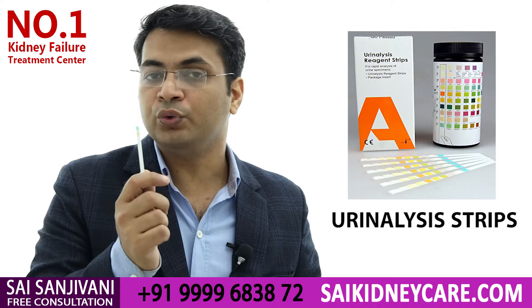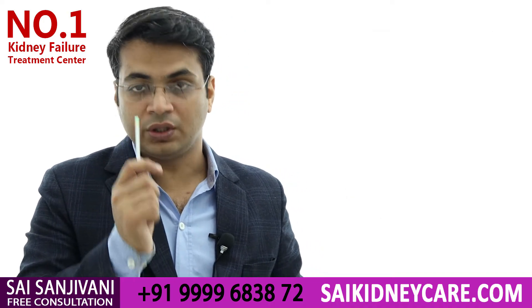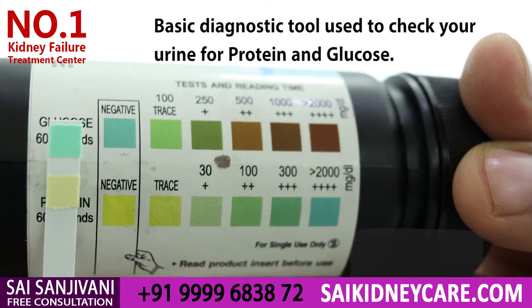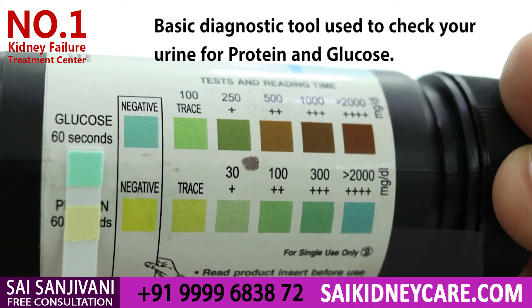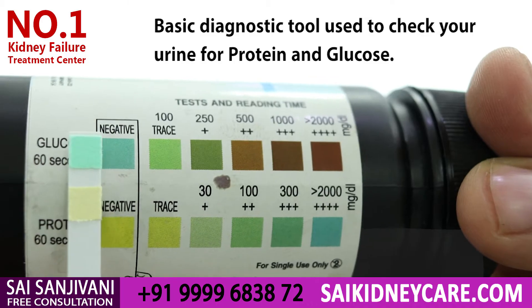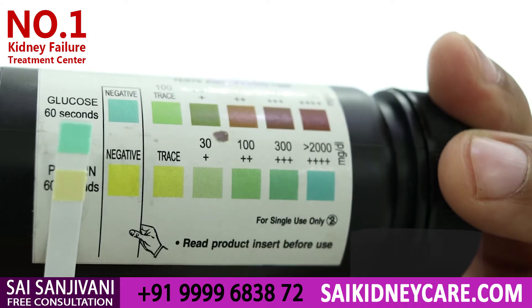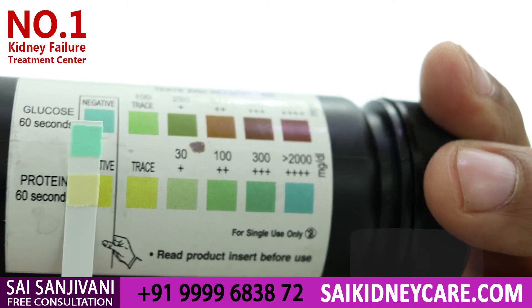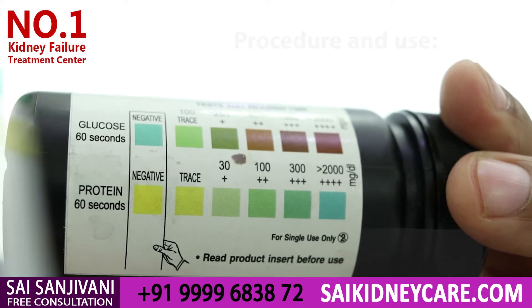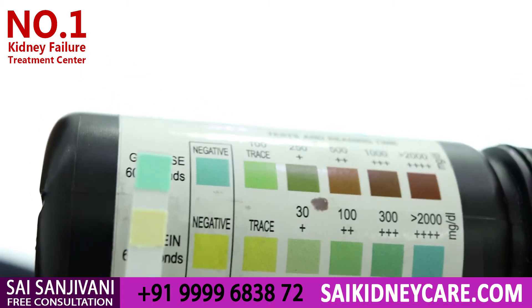If your urine contains albumin, this strip will change color. You can see the color chart given on the bottle. There are two pads on this strip: one is light green for glucose — and as you can see, this color matches the negative reference — and the other is for protein, which also currently matches the negative part. That means this strip has not been used yet.